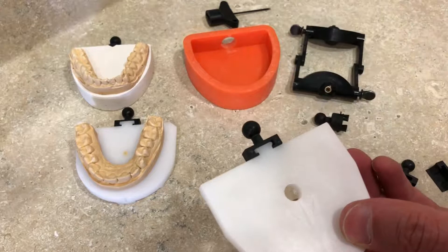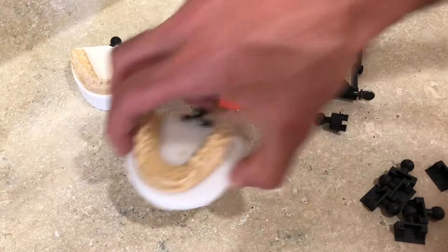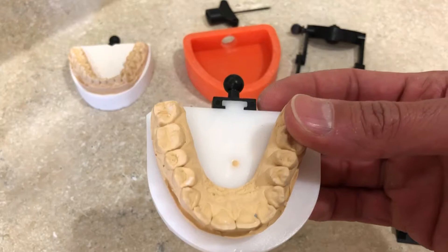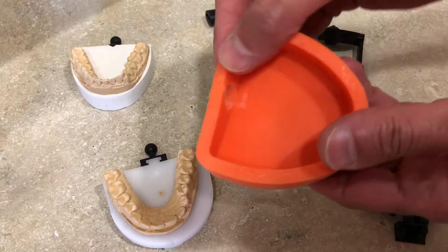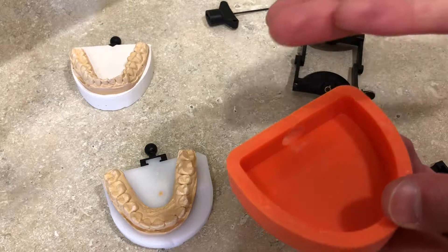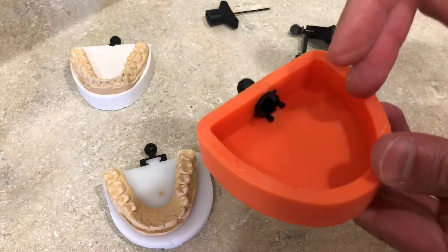In this case, we already have one already done. You can either do similar plates for the opposing and use two opposing plates, or you can have one of those rubber bases that we also sell to do your opposing model. We have different types of adapters for those rubber bases, which you slide right onto the back of the rubber base or silicone mold.